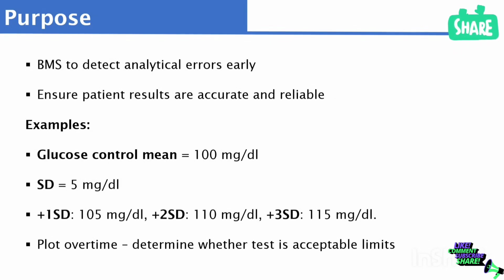In fact, if you don't detect this on time, this is one of the reasons why people may fail. I mean, the hospital or the laboratory may fail their external quality assessment, like NEQAS, as the case may be. So it's important, one, that there is error and it seems to be persistent. We need to investigate it, and detecting it on time will help in the investigation, and that can help to stop any potential negative impact on the patient result or the overall performance of that laboratory.